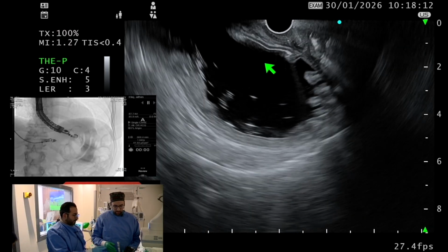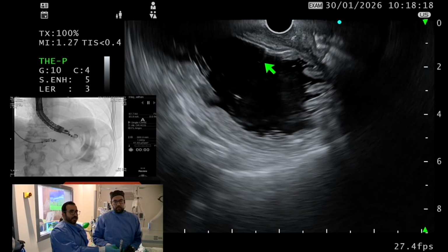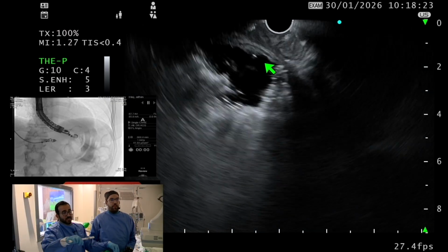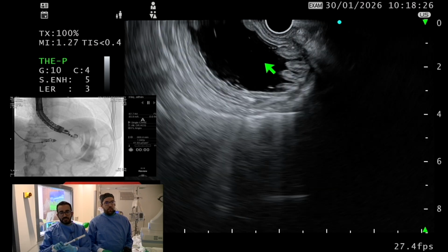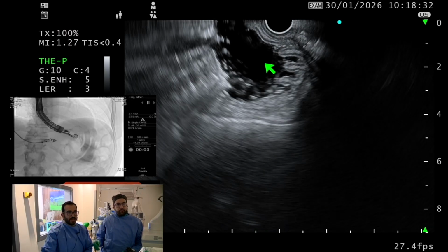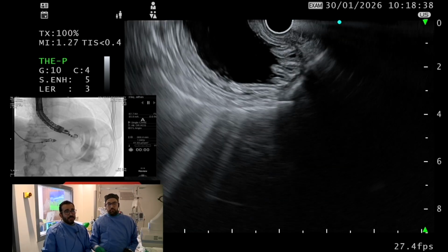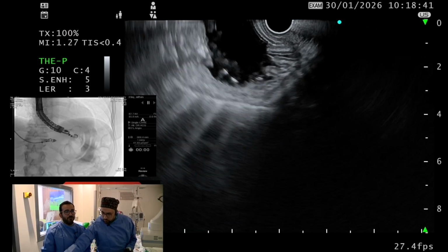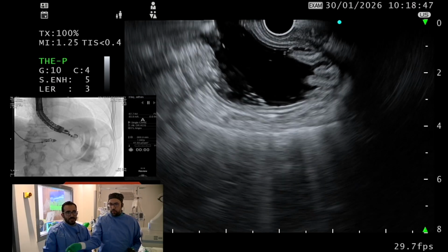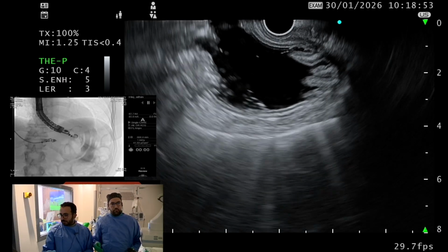So Dr. Nawaf, we're with you. It looks like the stomach is nicely inflated. Another thing for Dr. Hamad's question: this patient will definitely need a stent, like a biliary stent, to assess whether her cholestatic pattern improves after stenting, to decide about her post-liver transplant medication course. Another thing is how many stages to use to perform this EDGE procedure. Maybe we can ask the audience what their thoughts are about doing one stage or two stages in this particular patient.